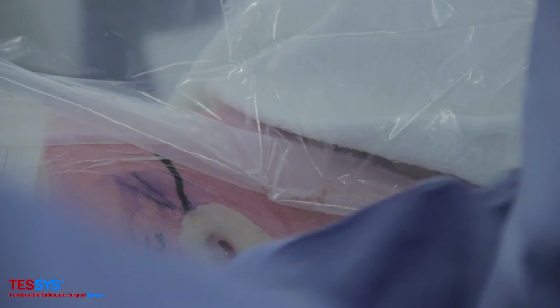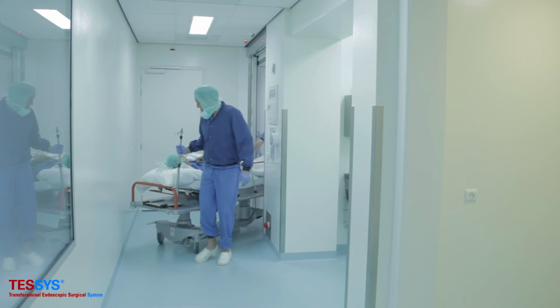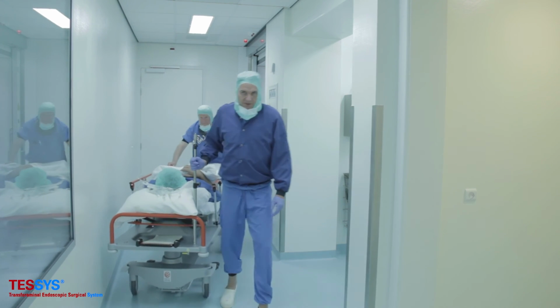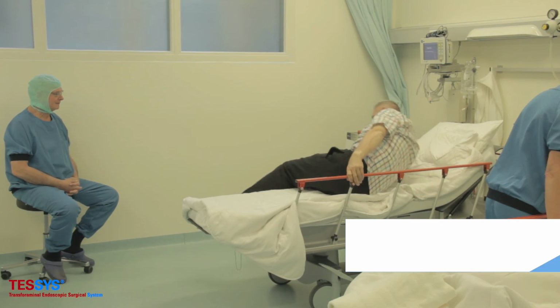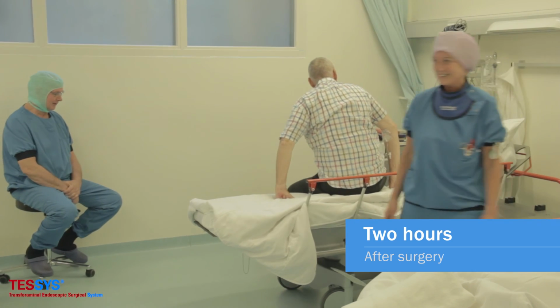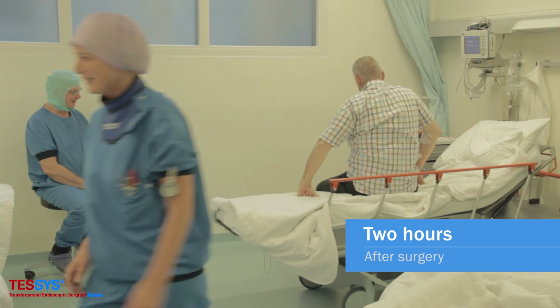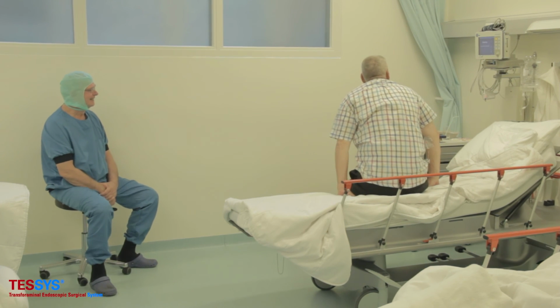The foramenoscope and working cannula are removed and the wound is closed with an intracutaneous stitch. The patient is transferred to the recovery and after checking his condition, discharged home within 2 hours. It's very important to make sure during the operation that you can see what you do and that you always know where you are.